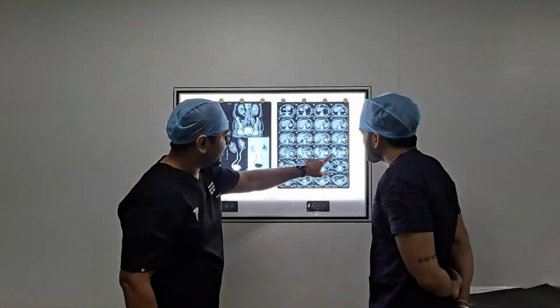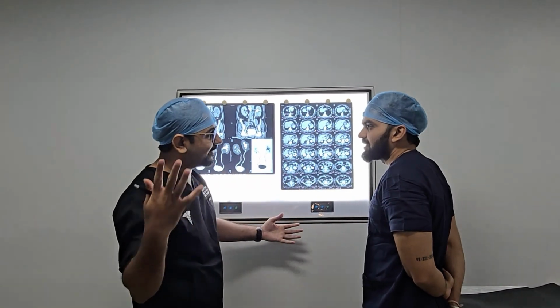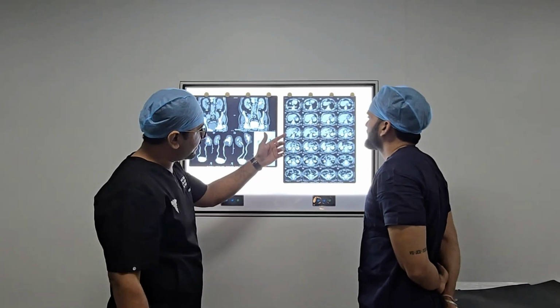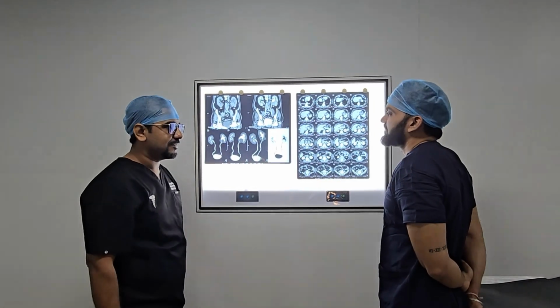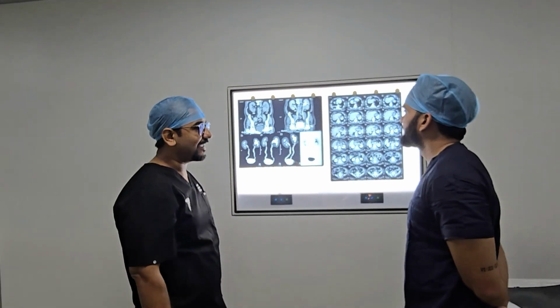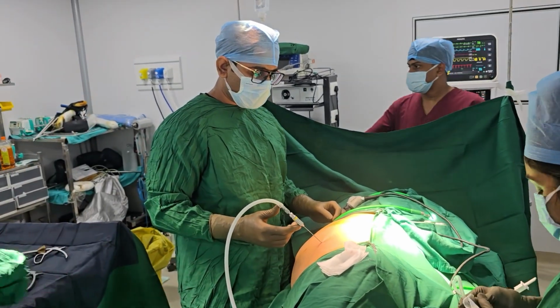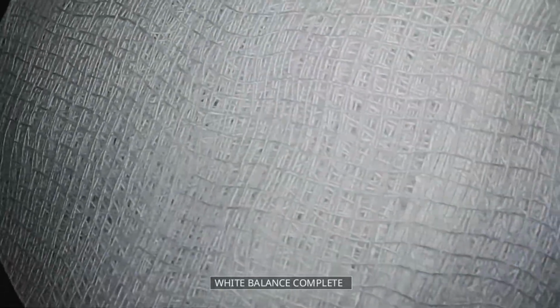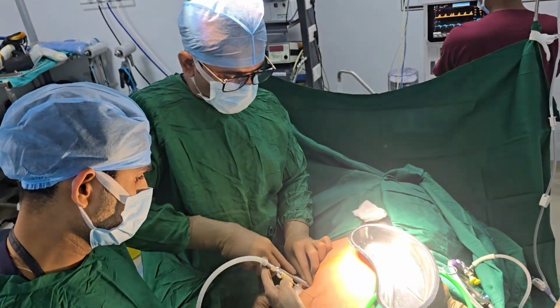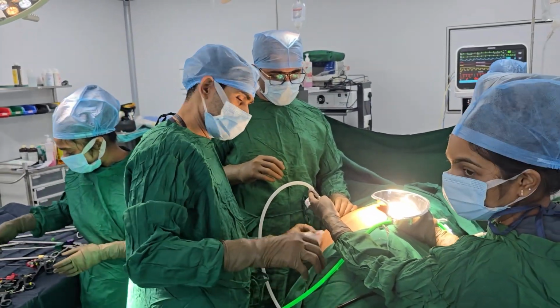So, per se, the mass in itself looks like a partial nephrectomy could be performed. But to do a partial nephrectomy in this case would make us cut open the mass, and that would breach the oncological safety. So, a shared decision was taken to perform a radical nephrectomy. The opposite kidney of this patient was absolutely normal, and the patient is a thin, lean case with no comorbidities. So, a decision was taken to perform a left side radical nephrectomy laparoscopically.